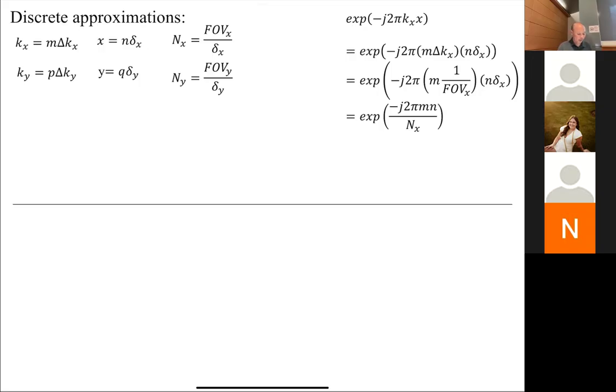All right. So far we've been talking about kx and ky, and now we're going to introduce what are called discrete approximations to sort of get you into linear algebra. Okay, so I know you had a problem on linear algebra for the homework, I guess, 4, and so that was just meant to help those of you who haven't done linear algebra for a while, just remember what linear algebra might be, just so that during this lecture you're not totally lost. Okay, but we're not expecting you to be linear algebra experts. I just want to give you a sense of how things are done.